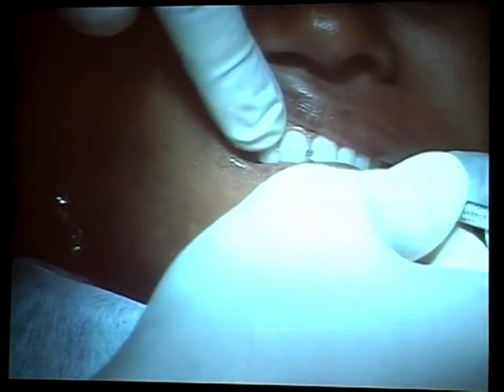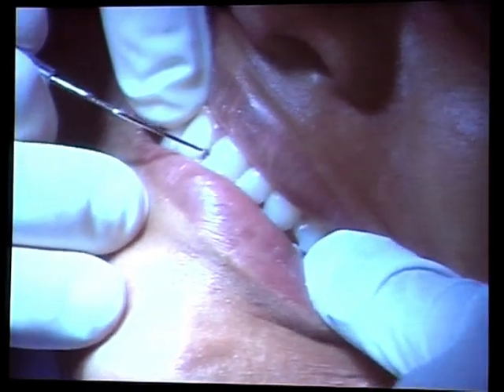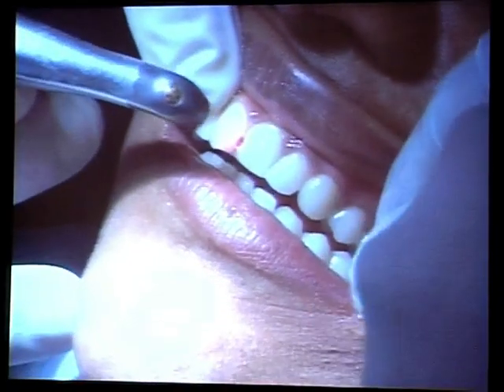Okay. We're nearly done now. Yep, it's hard already. Okay, with the same power settings, we will smoothen the edges a little bit.